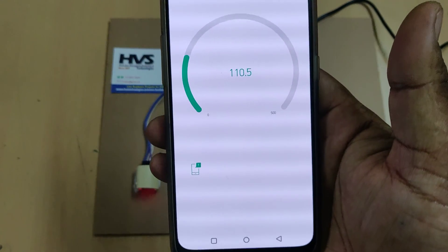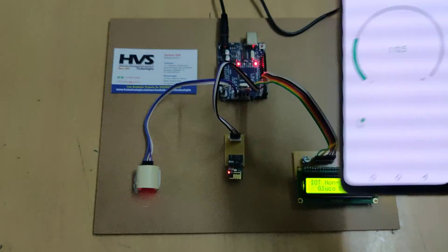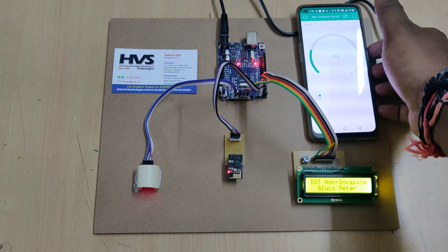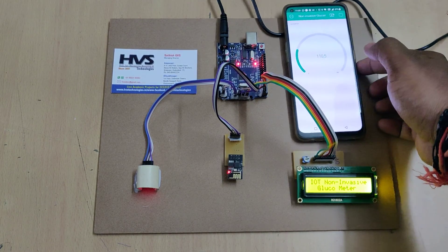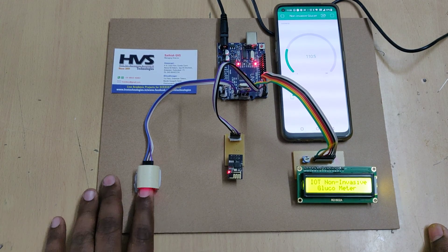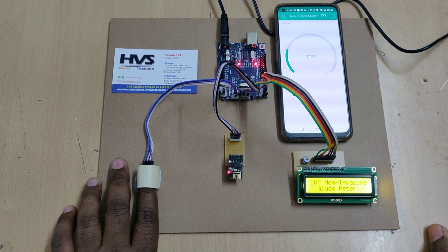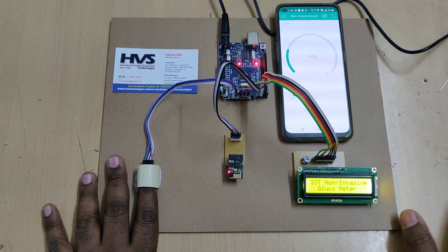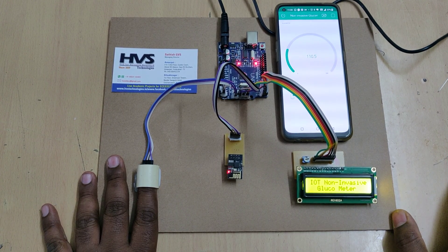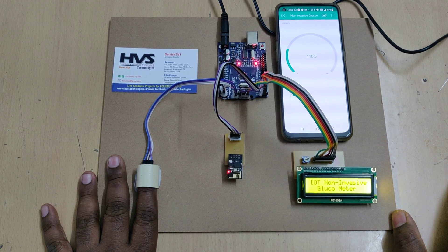There will be a welcome message on the LCD screen. The device is now online. Insert your finger — clean your finger without any dust so we get accurate values instead of fluctuating ones. It will take a maximum of five to ten seconds.